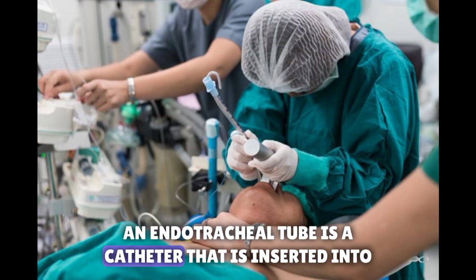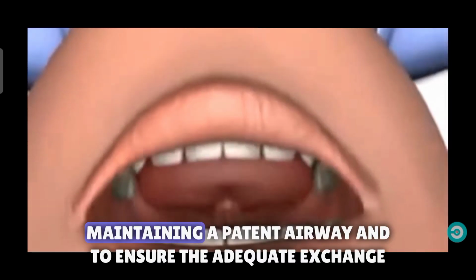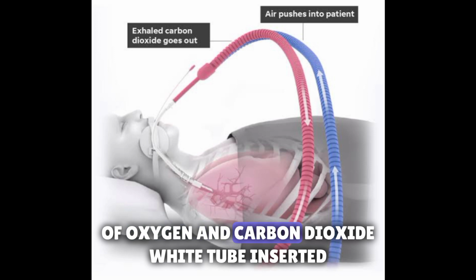An endotracheal tube is a catheter that is inserted into the trachea for the primary purpose of establishing and maintaining a patent airway and to ensure the adequate exchange of oxygen and carbon dioxide.